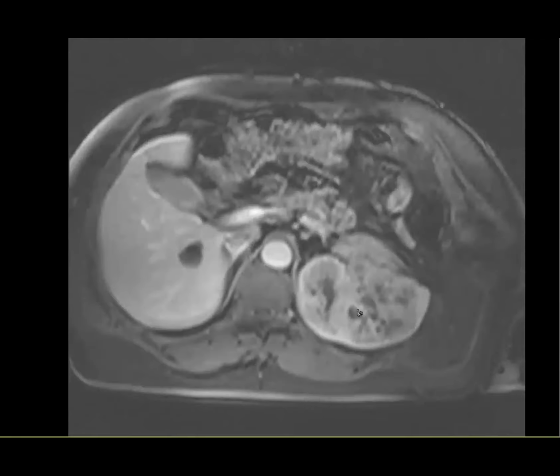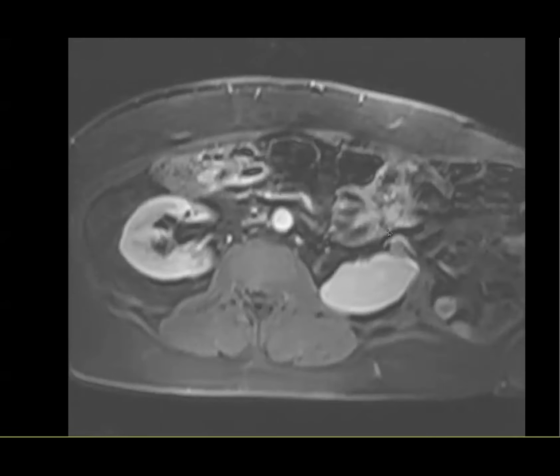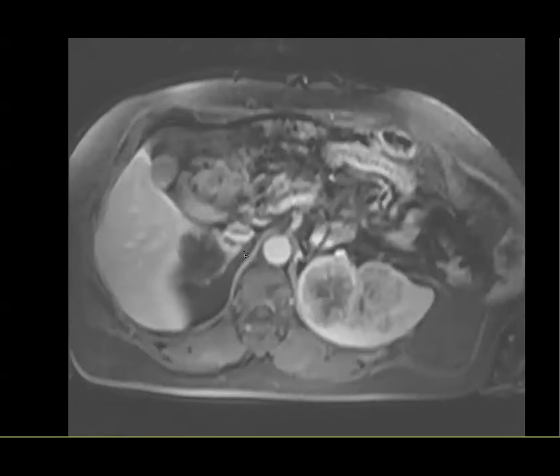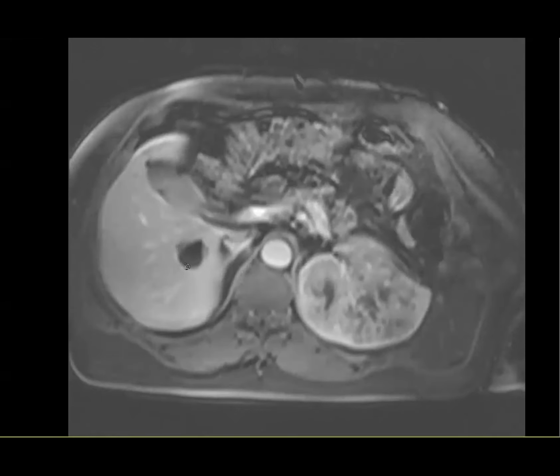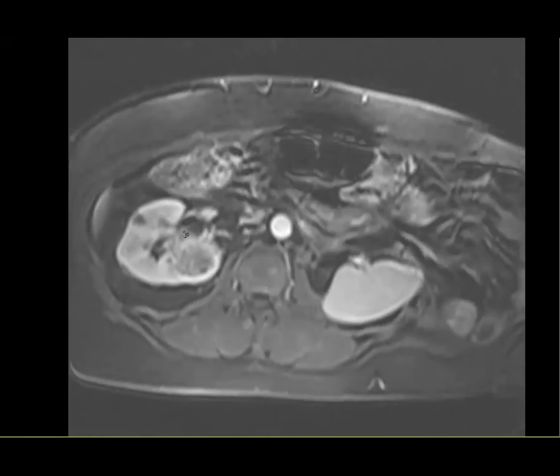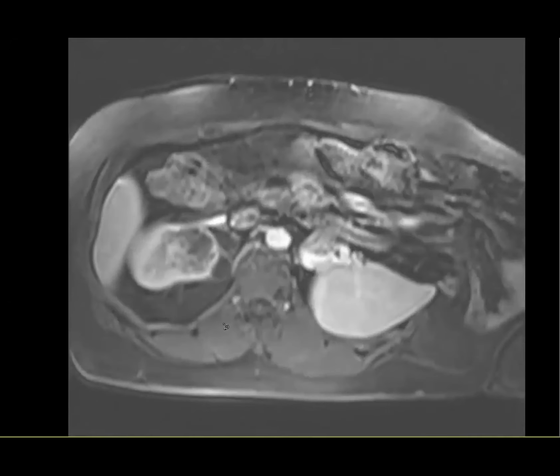Omar, since you're on, I'm going to quiz you. They look the same. I wonder if it's the same process. Yeah, but have you seen RCC? So do you think it's like an angiosarcoma going to the kidney, or do you think it's an RCC going to the spleen? I haven't personally seen RCC go to spleen, but I guess that's possible. Yeah, so this was the question in this case, which is that we were suspicious that this was a clear cell RCC. It had a lot of necrosis centrally.